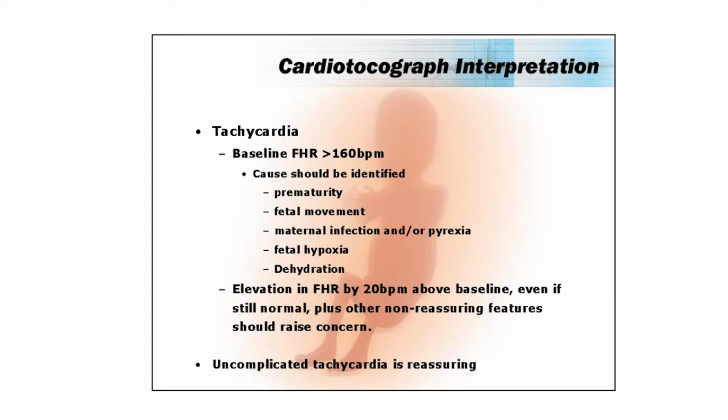Here's an interesting one. What's the normal baseline fetal heart rate? 110 to 160 beats a minute. How many of you have seen a CTG on a 32-week fetus? Hands up if you have. A 34-week fetus. Seen a CTG on a 34-week fetus? Yeah, lots of you have.